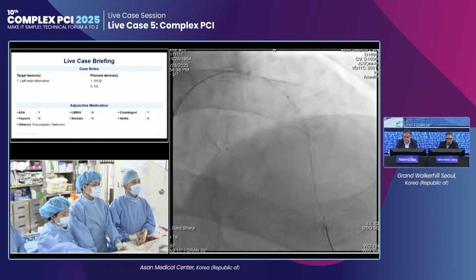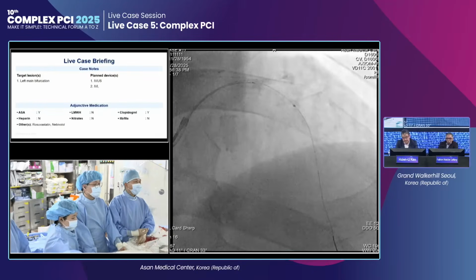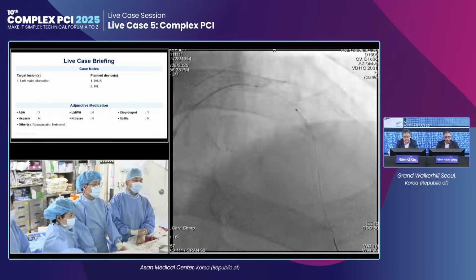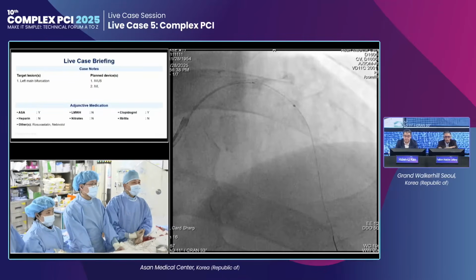I was stopped over there, right? And that's the LAD. That's right. Honestly, we tried, but the IVUS was stuck. For me, I would just open up an ablation device of my choice when I see that kind of calcium.